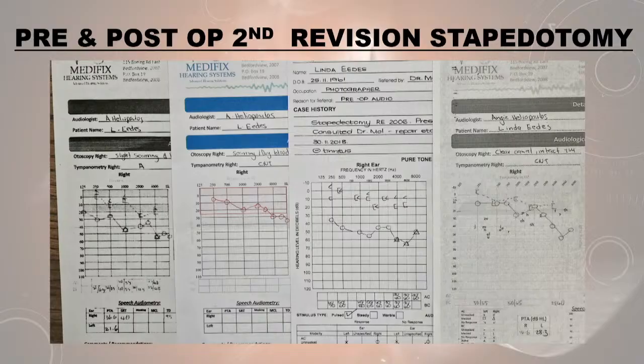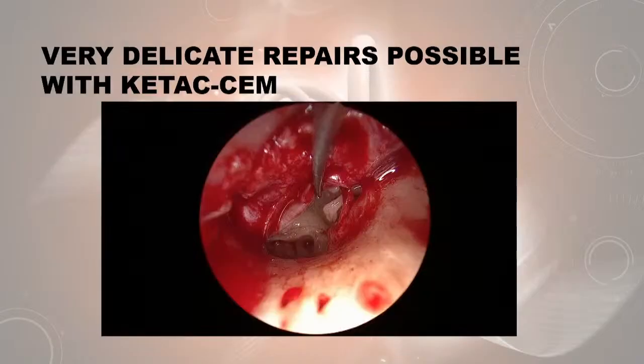And then 2 years later, 2.5 years later, she presented with this after a flight. We've repaired that, and that's what we're sitting with now. So that's the third revision. First and two revisions after that for her stapes.